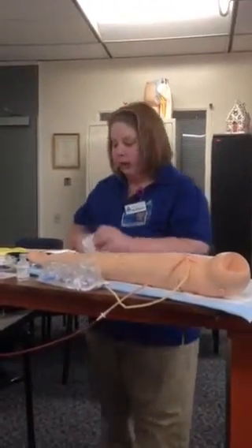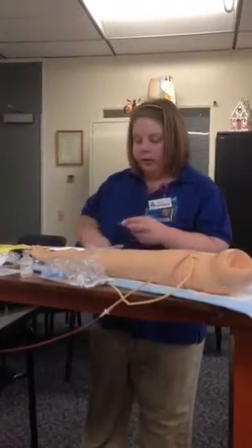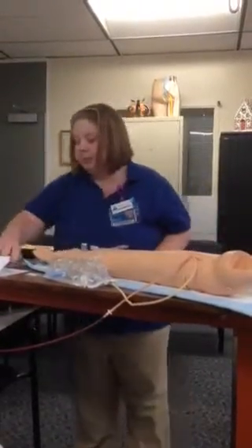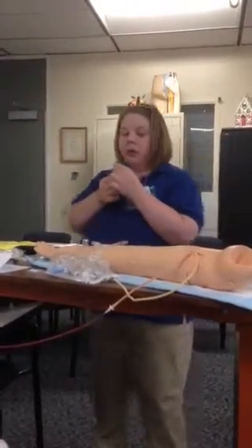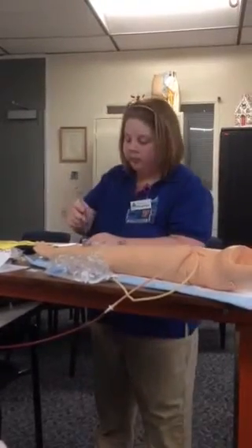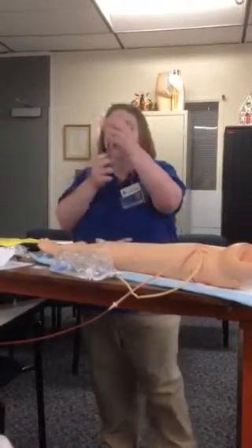I will first do my hand hygiene, clean off my medication bottle, and now draw up a milliliter of air, put it into my bottle, and take my milliliter of vancomycin out.